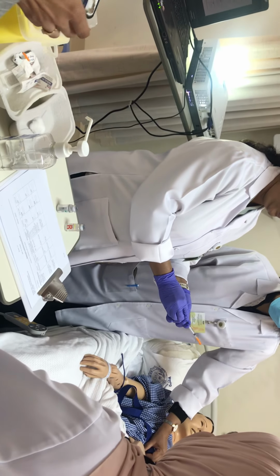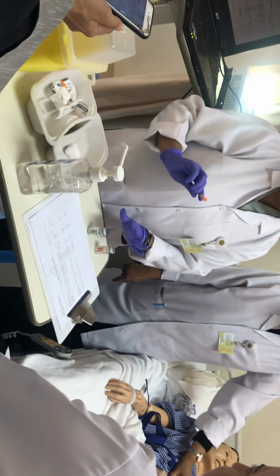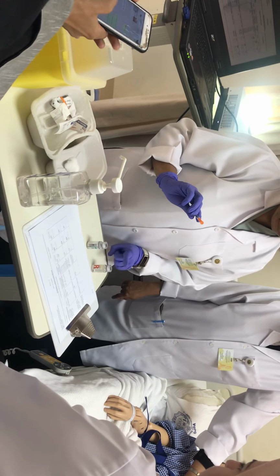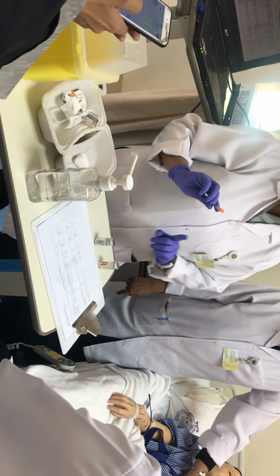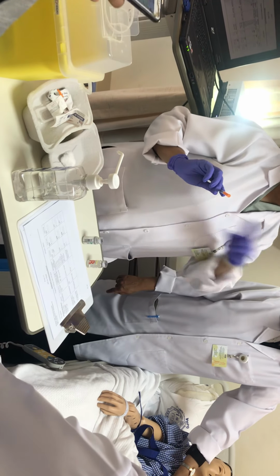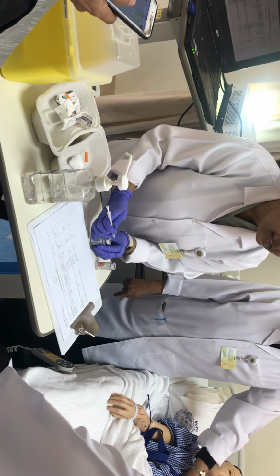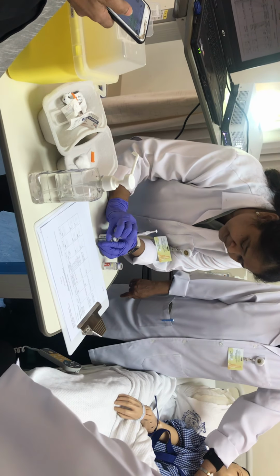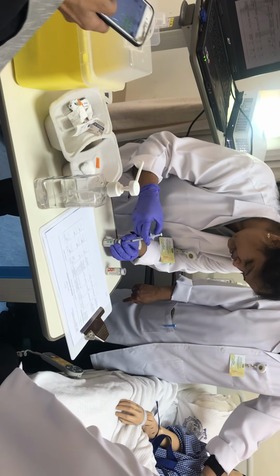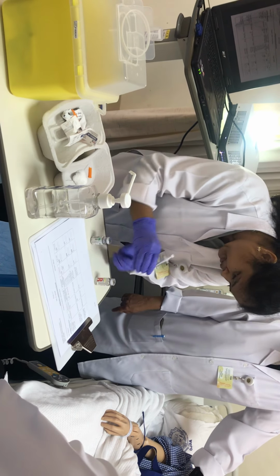So I take air 20. After taking 20, cleaning and all should be done. See, I need to take from this first, clear before cloudy. But when I push air, other way round. I always push air inside cloudy first. You see why? Then you will understand. Later you cannot push it. So only 10. Okay. Then come back over here.